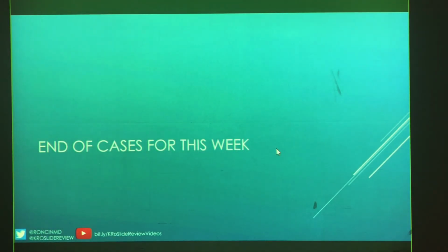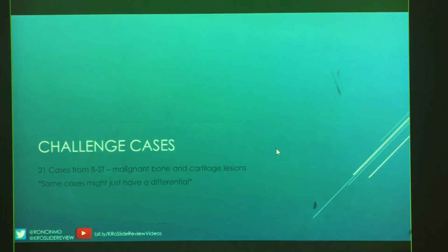Okay, and that's what we have for this week. So I hope you enjoyed the bone soft tissue series. For our challenge cases, we have 21 cases from bone soft tissue, malignant bone and cartilage lesions. As always, if I missed something, if I need to clarify something, please let me know so that we can all learn from each other and grow.